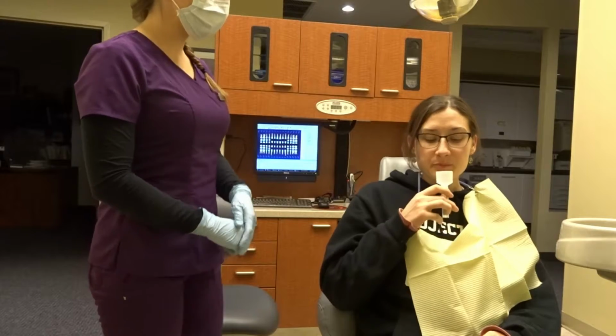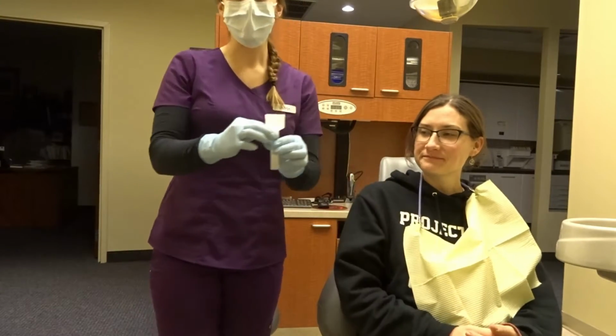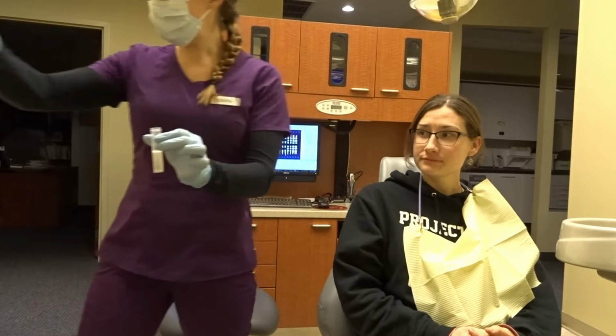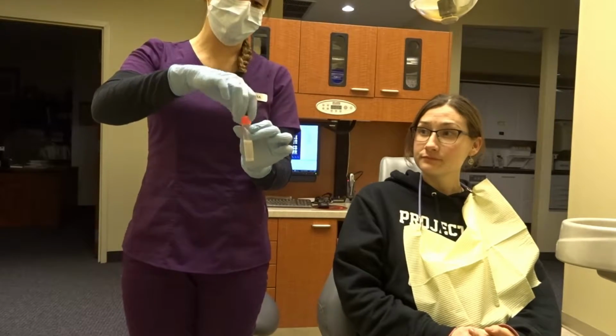Okay, you can expectorate. Perfect. Thank you. So once the patient has expectorated into the tube, you want to remove this top funnel piece and dispose and replace with the red plastic top.